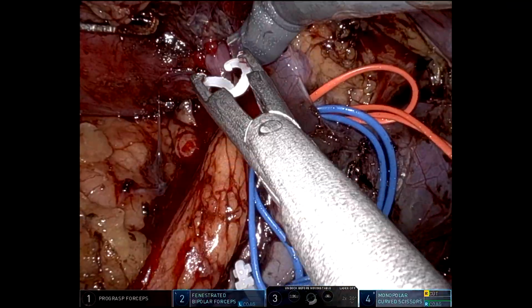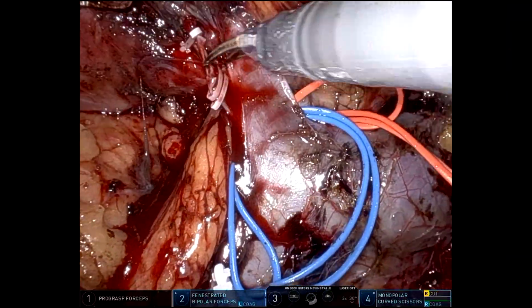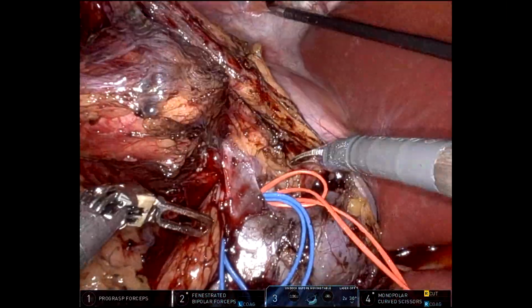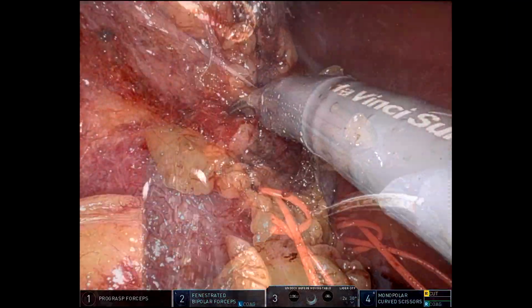A prominent vein draining from the tumor into the renal vein, as identified preoperatively on the 3D reconstruction, was isolated, clipped and divided. Then the hilar dissection was continued, posterior to the tumor, meticulously skeletonizing the renal vein, for clear exposure of the tumor, and to minimize the traction on the vein.